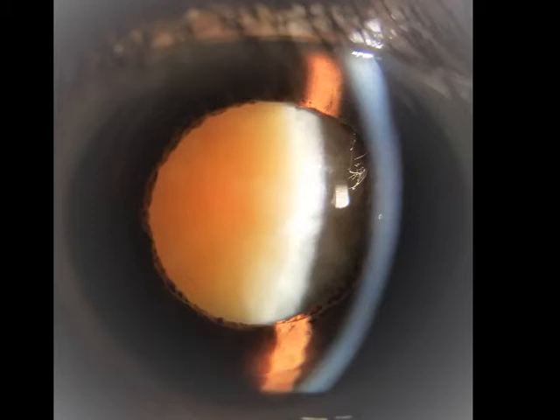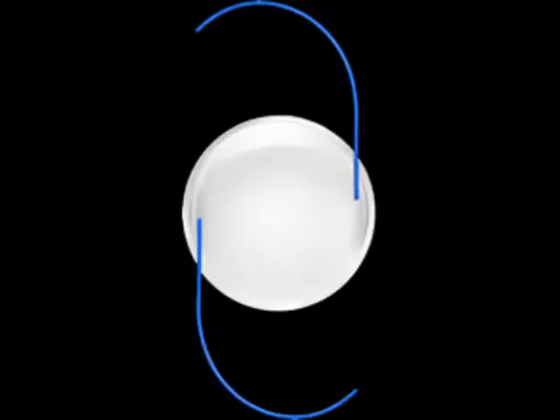After we take out your cloudy lens, an artificial lens implant that is made of either silicone or acrylic is placed into the thin, transparent lining or capsule of your original lens. Without the IOL, you will lose a large amount of the focusing power of your eye.